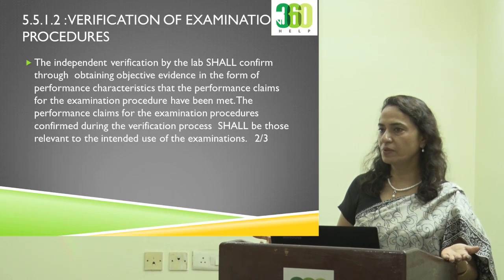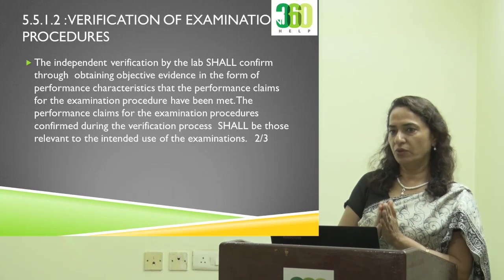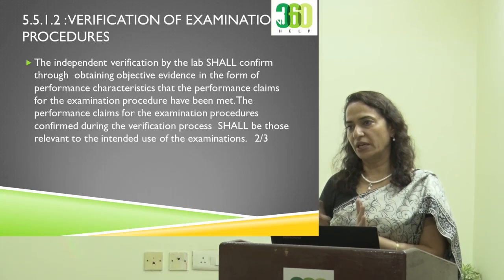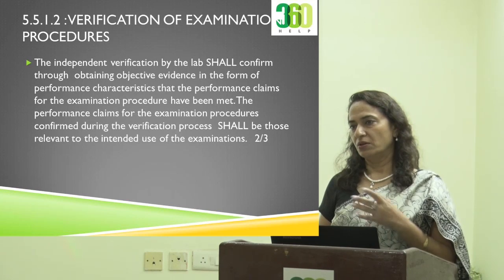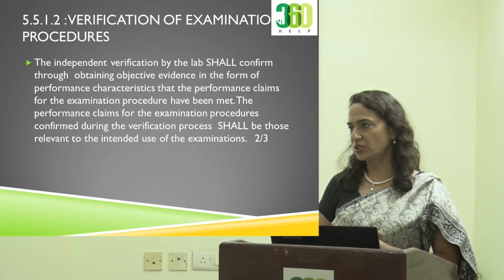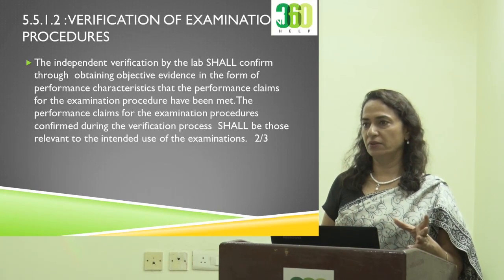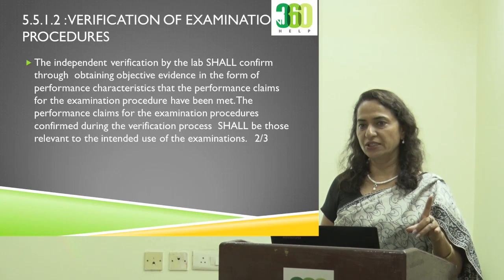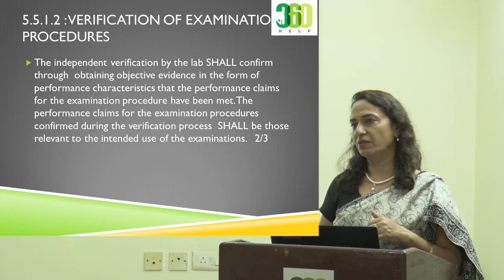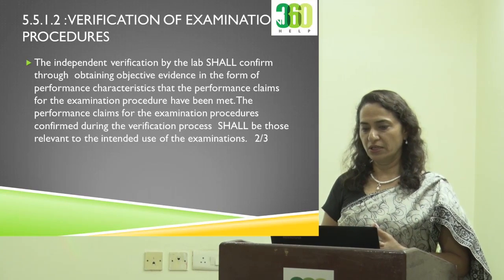So how do we do performance qualification of the test? By running QCs. You run QC for the first 20 days and then you check what was the performance. Is it coming within the required range, close to the mean, or is it changing, or is it different, or do you need to change the mean, or is it following LJ rules, Westgard rules? When you're plotting on the LJ chart, is it giving the required kind of curve that we are looking for? So that means you are checking the performance by quality controls.